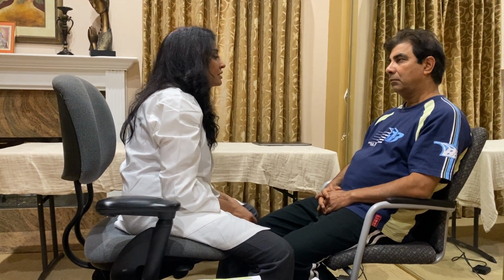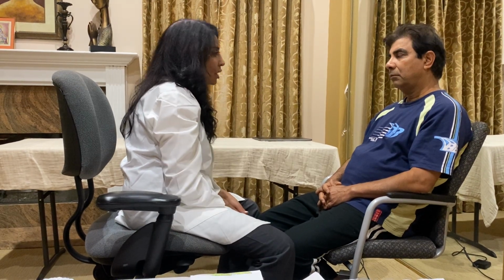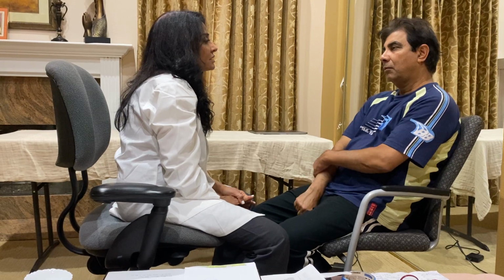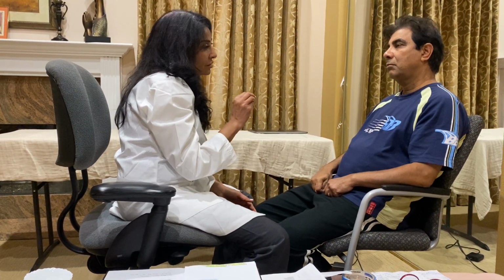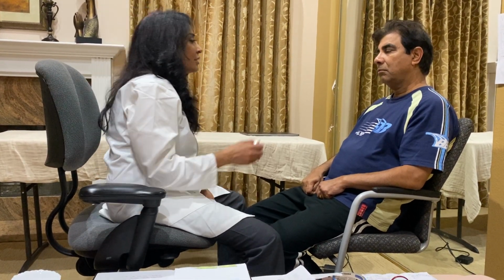I see that your iris is round and brown in color, and your pupil is small, less than 5 millimeters. And talking of pupil, let's check the pupillary response. So we will check your pupillary reflexes, and I'm going to check your direct and consensual reflex.